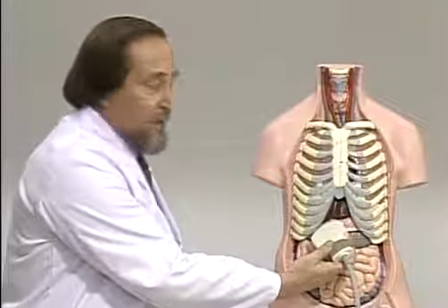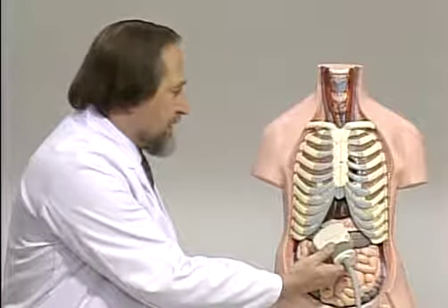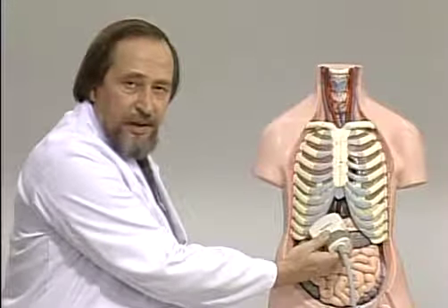That is to say, in a lean patient, the gallbladder is located lower than normally, while that of an obese patient is located higher. Bear this in mind, and you'll be able to detect the gallbladder rather quickly.